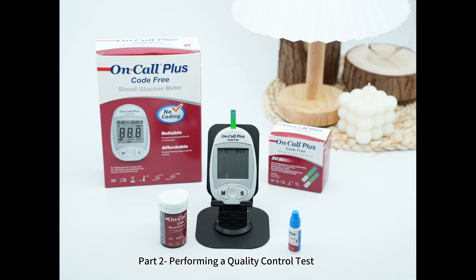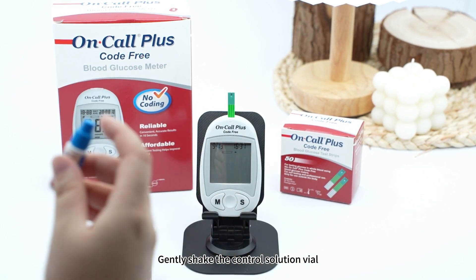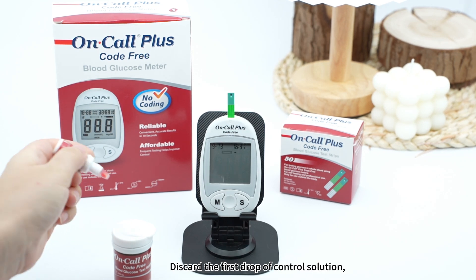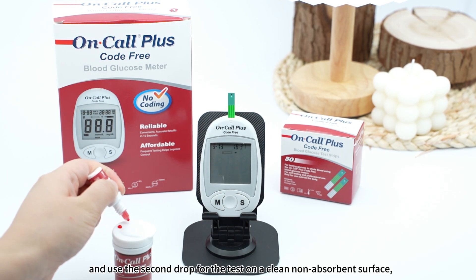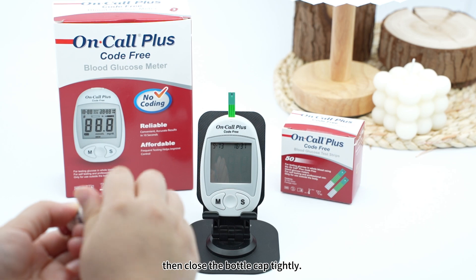Part 2: Performing a quality control test. Gently shake the control solution vial. Unscrew the control solution bottle cap. Discard the first drop of control solution, and use the second drop for the test on a clean, non-absorbent surface. Then close the bottle cap tightly.